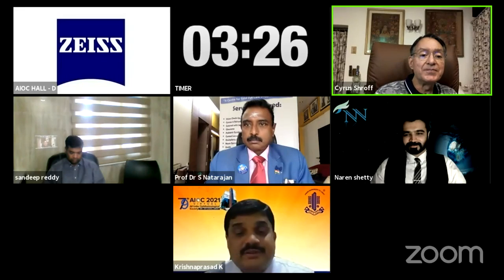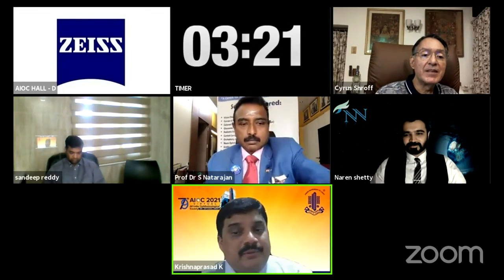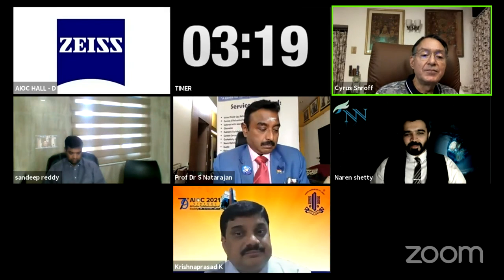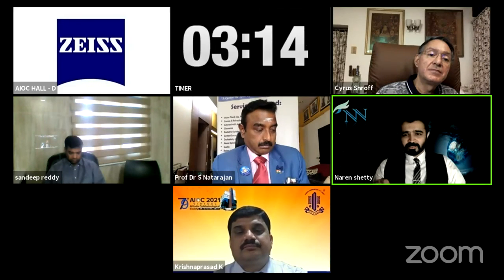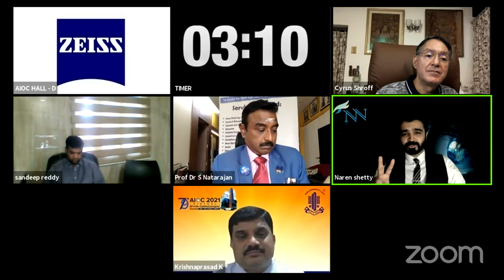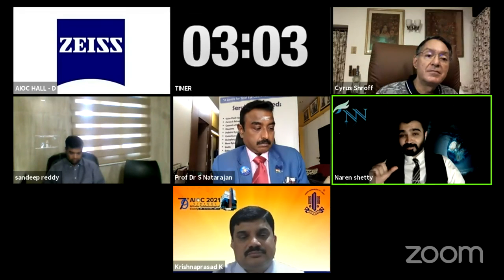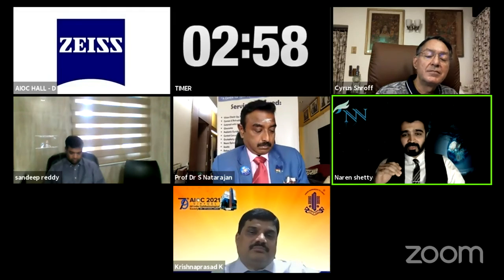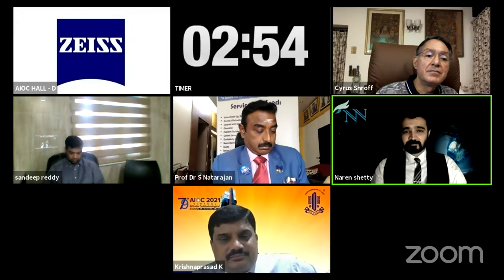The surgeon also, sir, cleaning the spectacles, the 3D spectacles also have to be maintained properly. Correct. One thing good about the 3D glasses is that they are very cheap, sir. Even if you buy them online, they are extremely cheap, because there are two types of 3D glasses, active and passive. This is the passive one. Passive ones are very cheap to buy, but the active ones are pretty expensive. Some TVs come with them. So I'm very happy that Zeiss has gone ahead with the passive 3D.